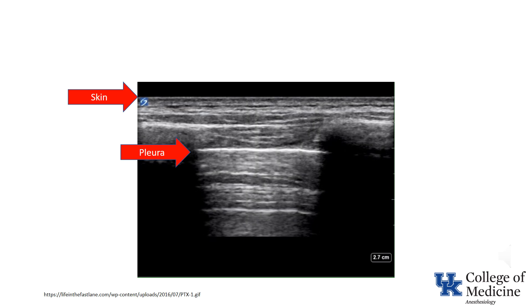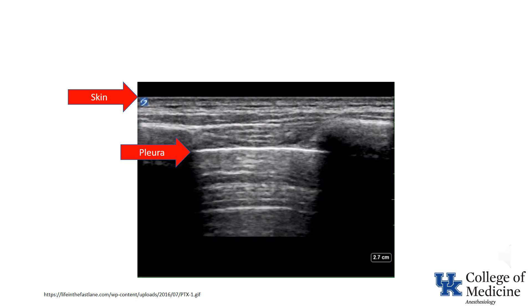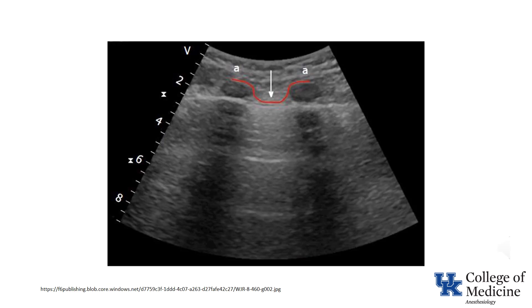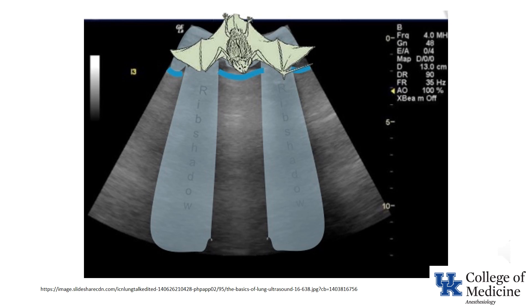This ultrasound demonstrates a normal pleural line. It appears as a horizontal hyperechoic structure below the ribs and represents the interface between the visceral and parietal pleura. The image produced by the ribs with their acoustic shadowing and the hyperechoic pleural line has been termed the bat sign. Purportedly, the pleural line represents the body of the bat and the two ribs represent its wings.